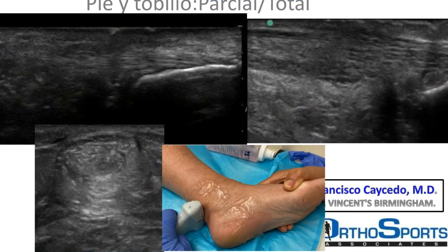And again, that's a beautiful picture. You have here the calcaneus, the insertion of the Achilles tendon. If we go more proximal, you can see the gap. This black anechoic area is present in all the inclinations, so that means it's real. The patient has pain. And one of the patterns that I always see is the rupture or the degeneration of the non-insertional Achilles tendinitis, where the rupture is more in the core, meaning the center.